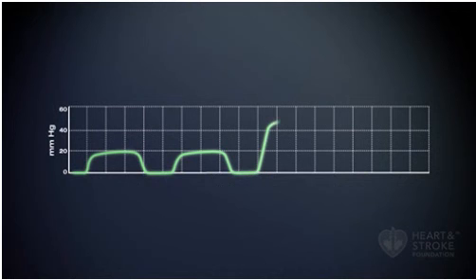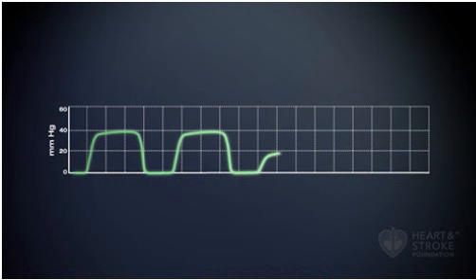When the waveform jumps up during resuscitation, this may indicate ROSC. A sudden drop in waveform of 20 points or more could indicate a sudden, severe decrease in cardiac output that might be caused by a pulmonary embolus, acute blood loss, or a life-threatening arrhythmia. A decrease to 0 indicates no gas exchange or no carbon dioxide delivery, such as occurs with a displaced endotracheal tube, or the sudden stopping of blood flow, such as occurs with ventricular fibrillation.